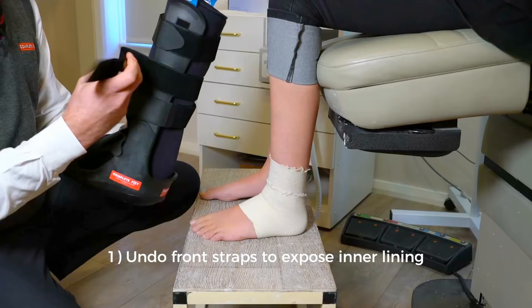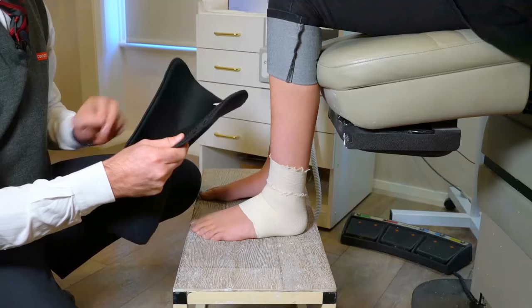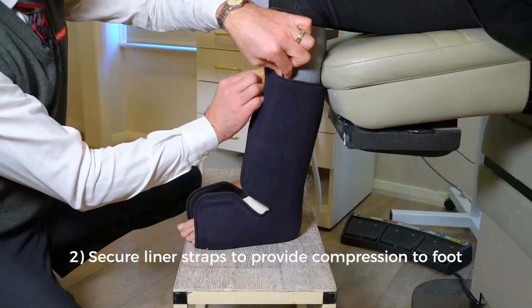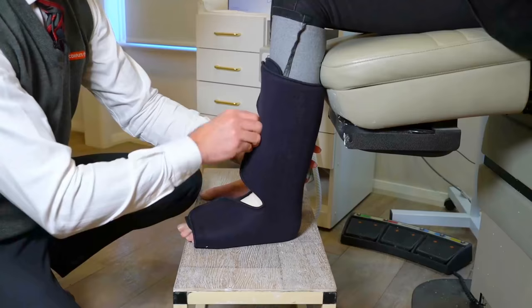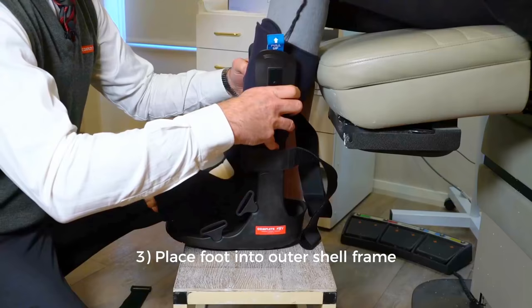So we undo the straps to expose the liner underneath. We're going to get this fitted up nice and snug around the foot and ankle. Lift your foot up and gently ease it into the back — that's it. We pull both flaps around nice and firm, so we're actually getting some compression out of the liner as well as the tubular support bandage underneath. Does it feel okay? If you lift your foot up, we're going to ease your foot gently back into the frame.